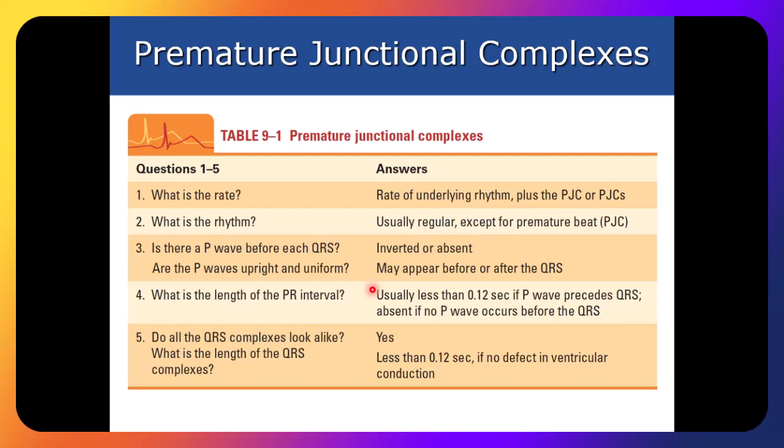So you have that atrial depolarization, and now it comes on down to the ventricular depolarization. Does that make sense? I was looking at a strip of a PAC, and there's one where, in between the QRS complexes, there's one wave in front of it. So my interpretation was that it was embedded in there. If you can do a screenshot and send it to me, I'll be happy to look at it.